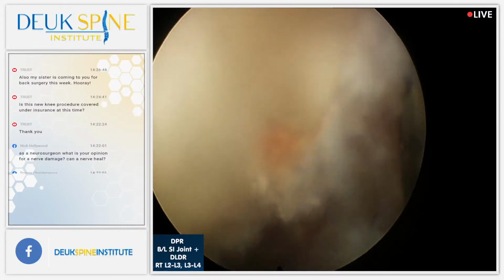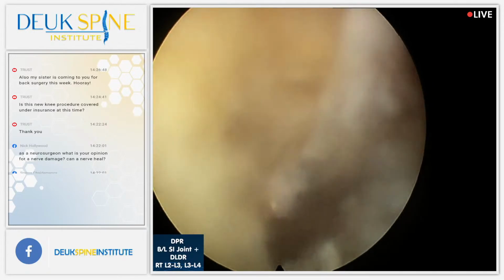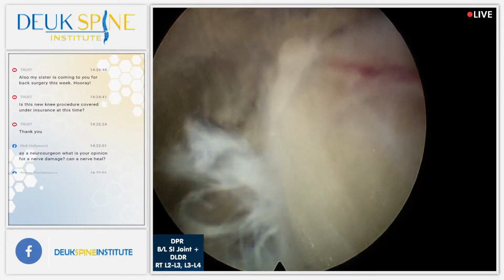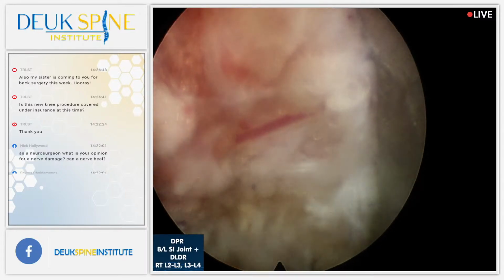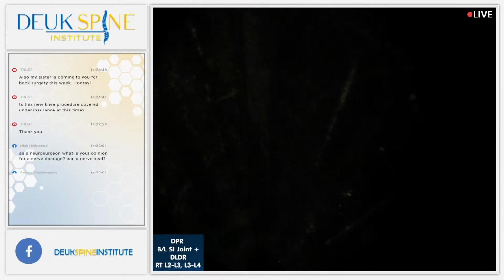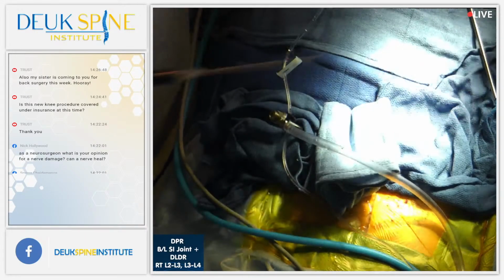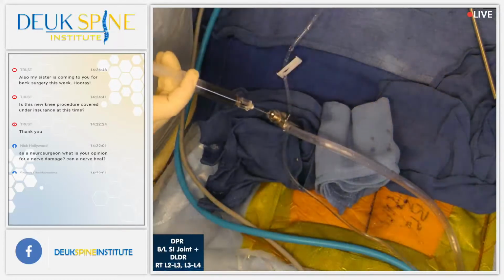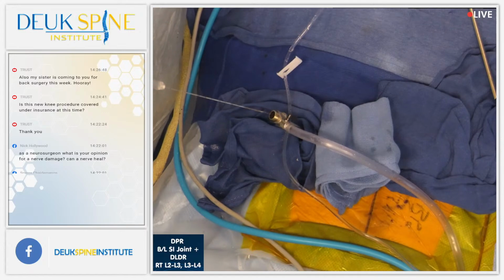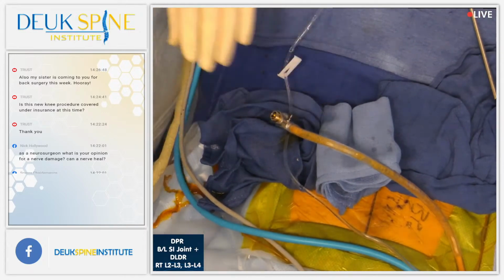Wonderful. So even though she didn't have any leg symptoms, the nerve was getting pinched. That's it. Scope off. We are done. We've done 2 discs and 2 SI joints on her, the lady from Texas. And type your questions up. I'll be happy to answer them for you.